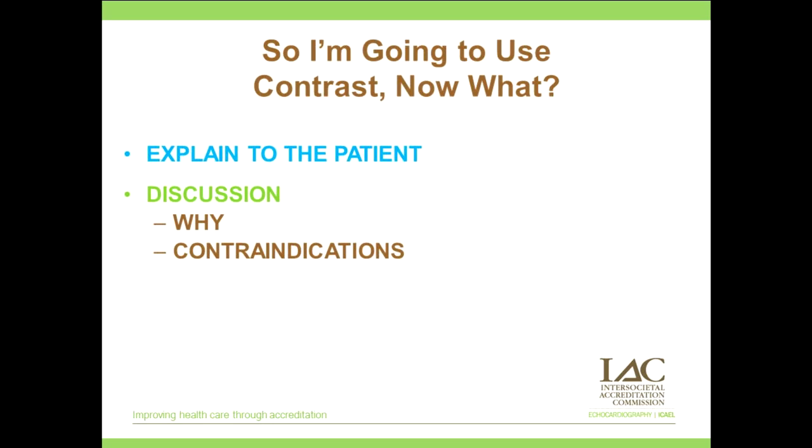I also ask my patients if they've ever had a reaction to perflutren. And again, with my female patients in childbearing years, the issue of pregnancy or nursing needs to be addressed. And with Optison, you'll want to address the issue of blood products and albumin. Part of your policy should also address the warnings of contrast. I explain to my patients the risk is very low, adverse events are very rare but can occur. And then I have a brief discussion on adverse effects.